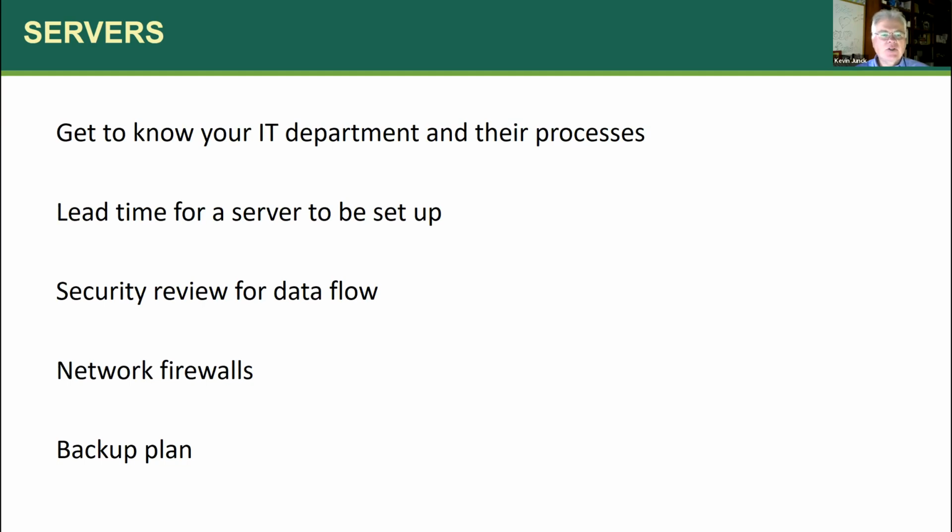We've got images that have PHI on them. We've got to make sure things are handled appropriately and securely, especially if they're going off site. Does the gateway de-identify images before they go to the cloud and then re-identify them when the images come back from the cloud? Or is that PHI actually leaving our institution and going out there into the cloud? Got to understand the whole flow and understand what the problems are.